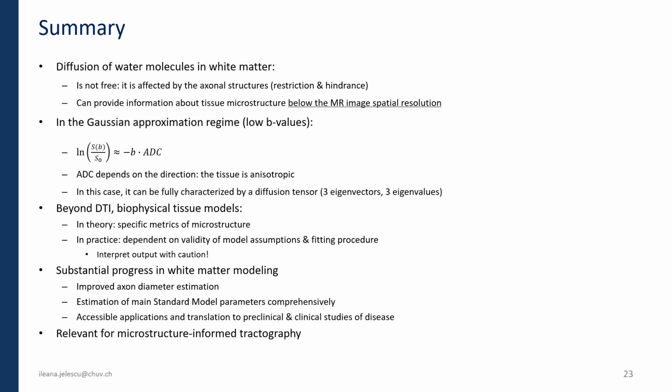Finally, all of these microstructure features are highly relevant for cleaning up or making more sense of tractography information, as you will see in the rest of the course. And I've included some reviews on white matter modeling if you wish to read more about this research.